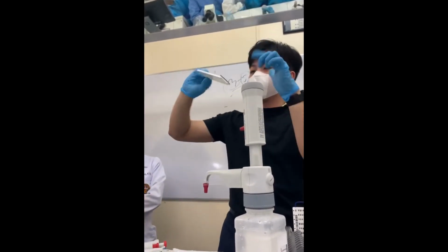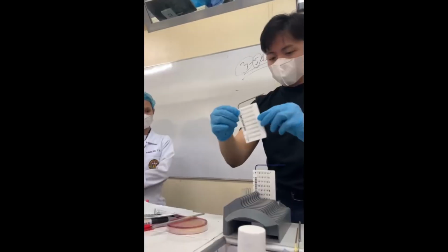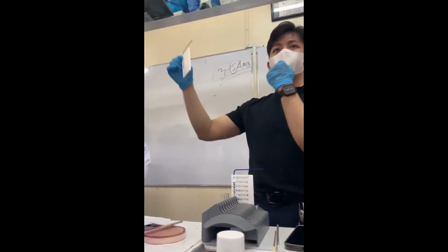Okay? Then, as you can see, it is barcoded too. So, since it is barcoded, the laboratory should have a LIS. Blue is the transfer tube for identification and gray for AST.